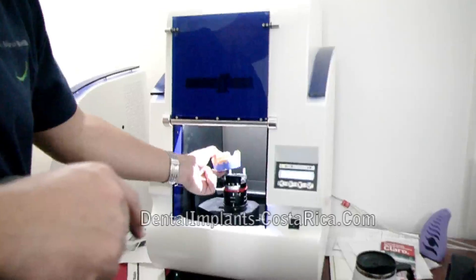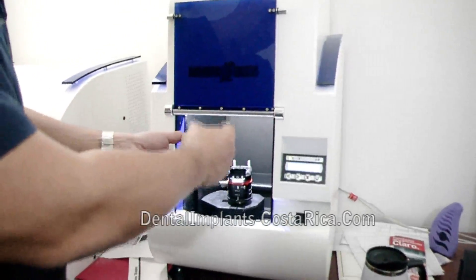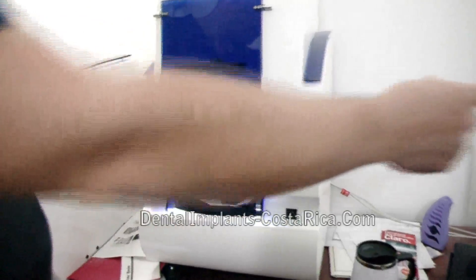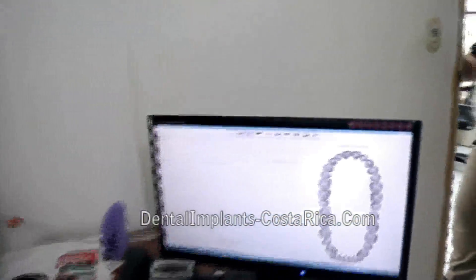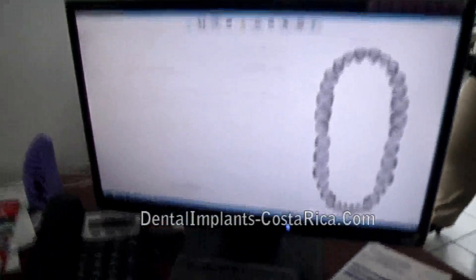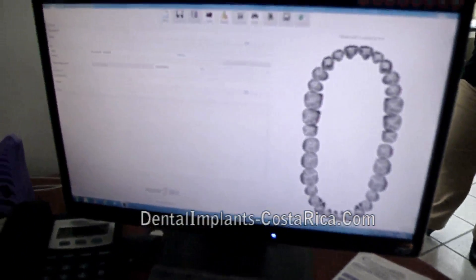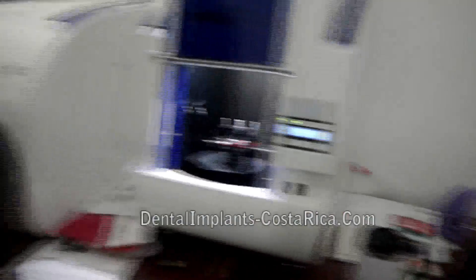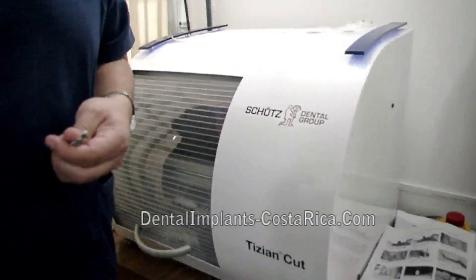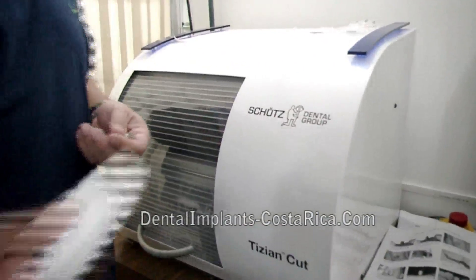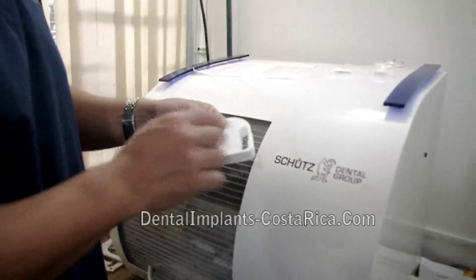So it goes in here. What it does is it just reads that and the computer would build it. After the information is done, the computer sends the information to this machine here. And out of this material that goes in there, it creates a crown.